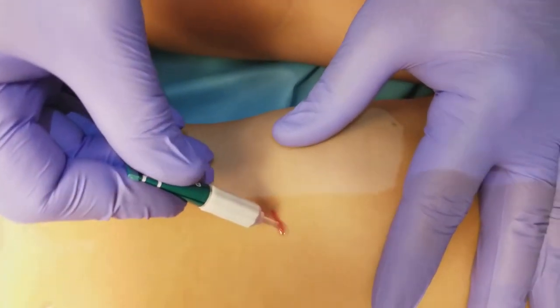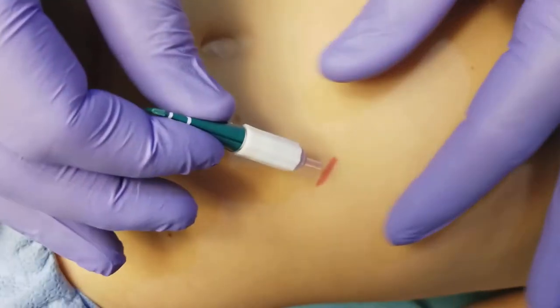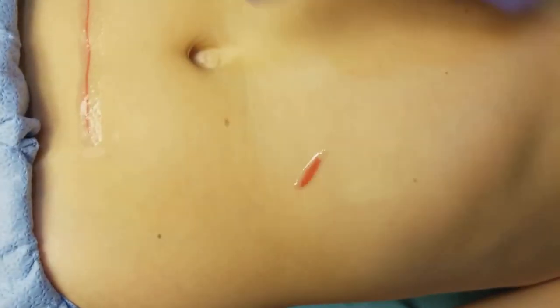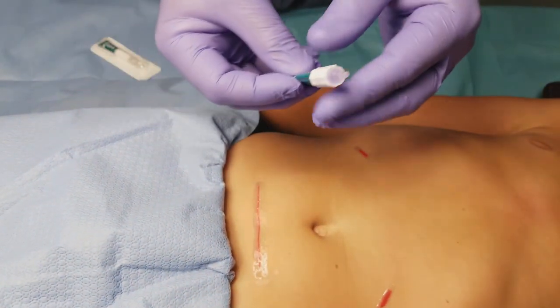With the fine point tip, you can go down and apply a smaller amount of glue over the wound site. Make sure edges are approximated, and you can do a smaller amount of glue instead of the larger swipe. And that's it — thank you.